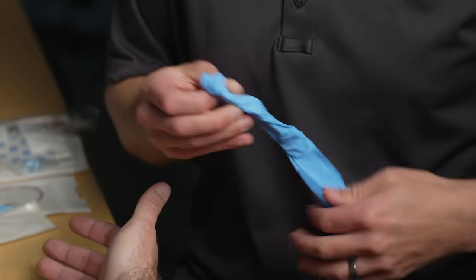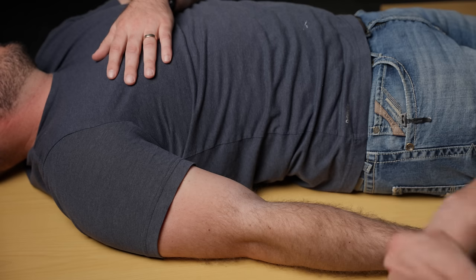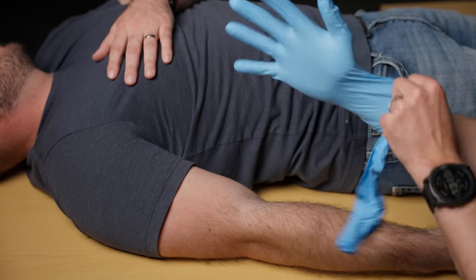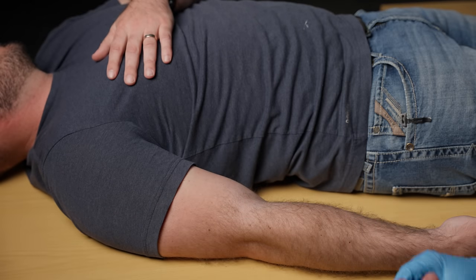The first thing I'm going to do is put on my personal protective equipment. You want to make sure these gloves fit as best you can — this protects you as well as the patient. You'll never have a harder time getting gloves on than when you're doing it in front of somebody or in front of a camera.